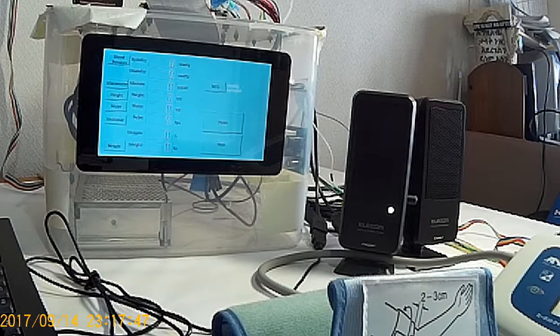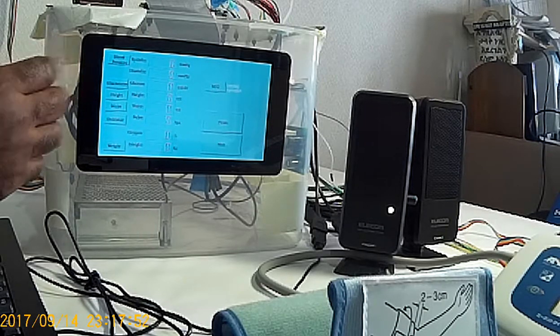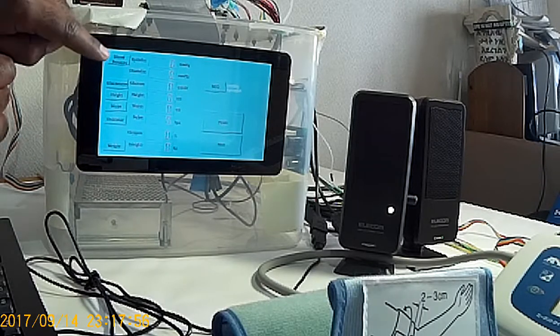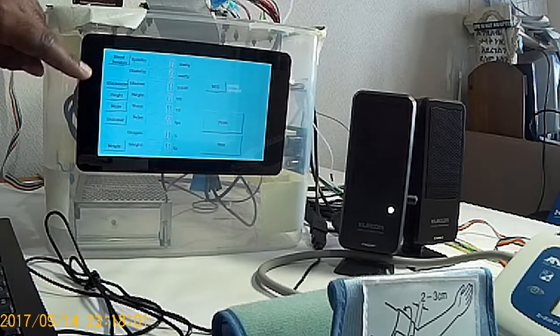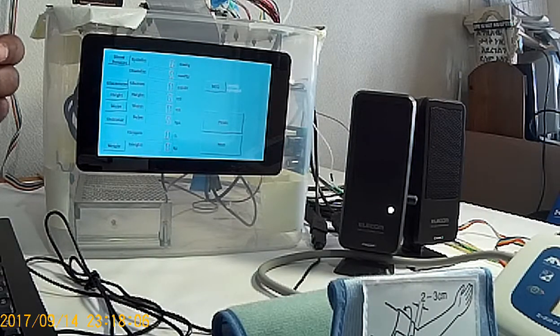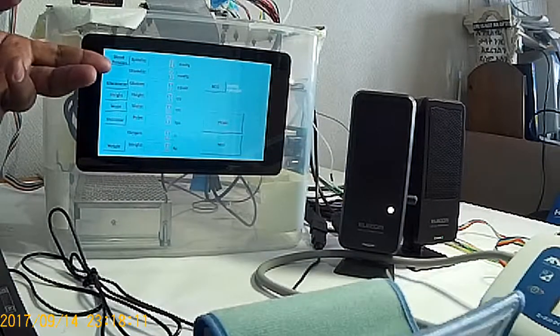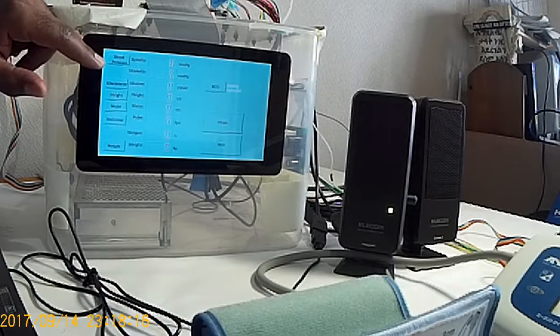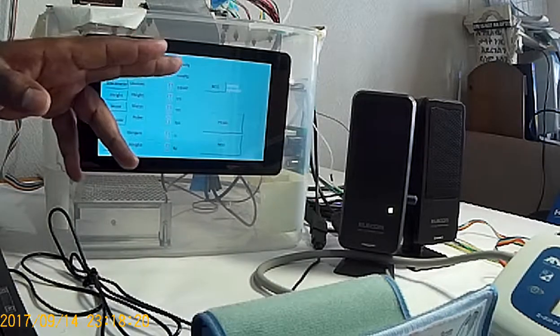On top of that, more detailed instructions can also be prepared for each command, and then the user will have a better understanding of what's going to happen. In this case, I'm going to do a blood pressure measurement. I'm going to trigger the process by pressing this button on top here, and I will see the systolic and diastolic blood pressure measurements in millimeters of mercury.